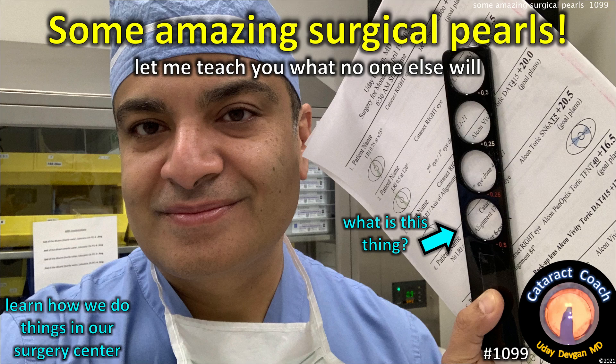Welcome to cataractcoach.com. Let me teach you some amazing surgical pearls. Welcome to my operating room — let me show you how we do things. Good morning from Beverly Hills, we're here ready to do surgery.